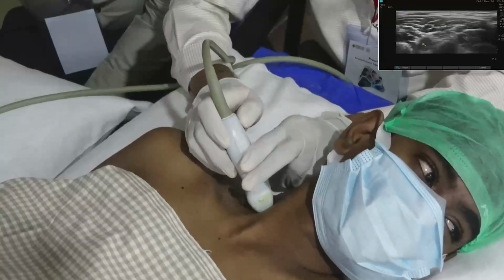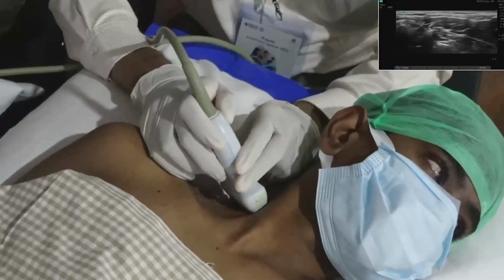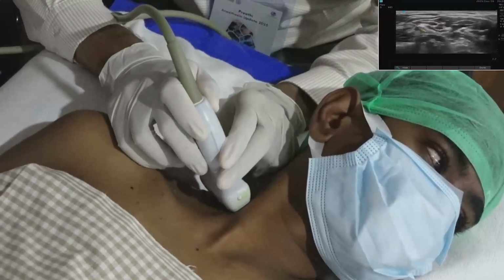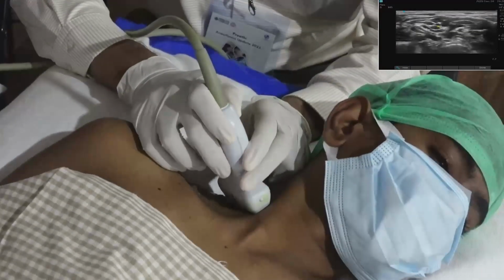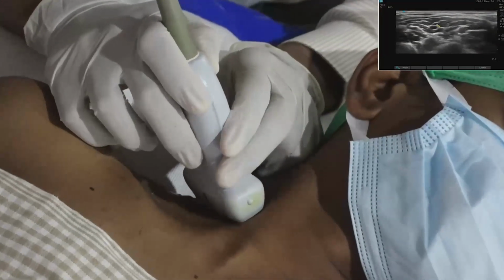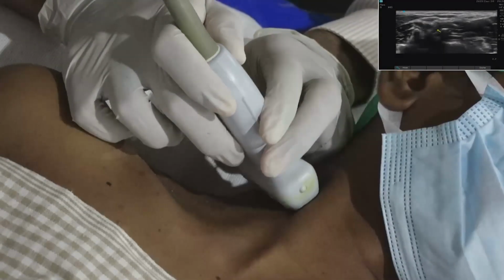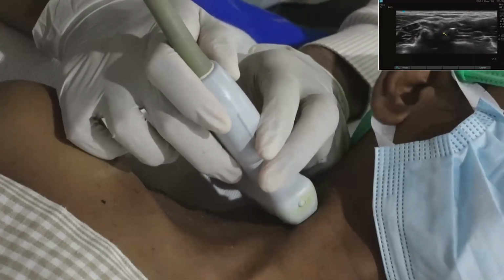And next level, C6 component. In C6 we see the prominent chassaignac tubercle. C6 is coming out and it is immediately dividing. That is a very important point we have to note. So it is not again C7, it is C6 only dividing into two. And further moving cranially, we can identify C5, where the anterior tubercle and posterior tubercle are both equal in size.